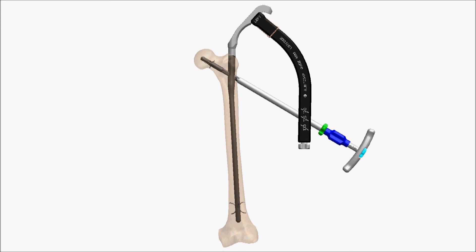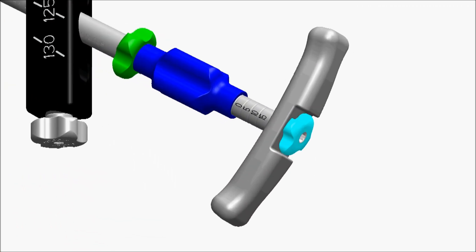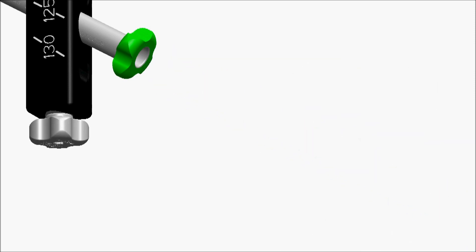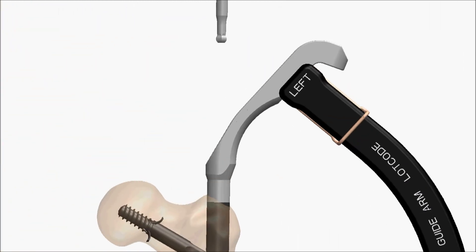If satisfied with the final position of the implant, release the lag screw from the lag driver. Loosen the guide lock and remove the guide sleeve. Release the nail from the guide arm.